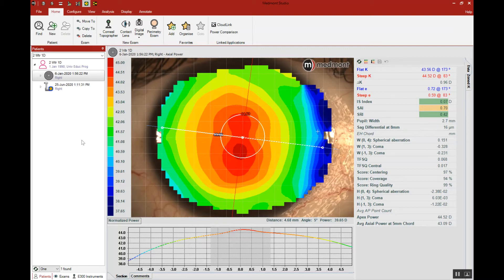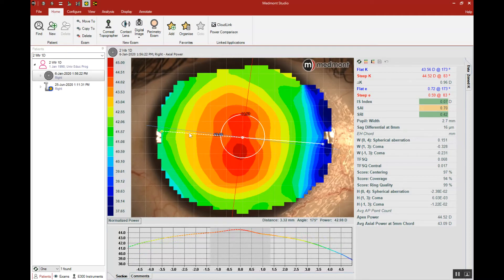Let's look at this very normal with-the-rule cornea. Here we have a prolate cornea, steepest in the center, flattest toward the periphery, and that's seen on the graph below across this white line. As we go from the steepest curvature in the center to the flatter curvature toward the peripheral cornea and limbus, we see this constant change in eye shape, and that's given as an e-value that you see here.